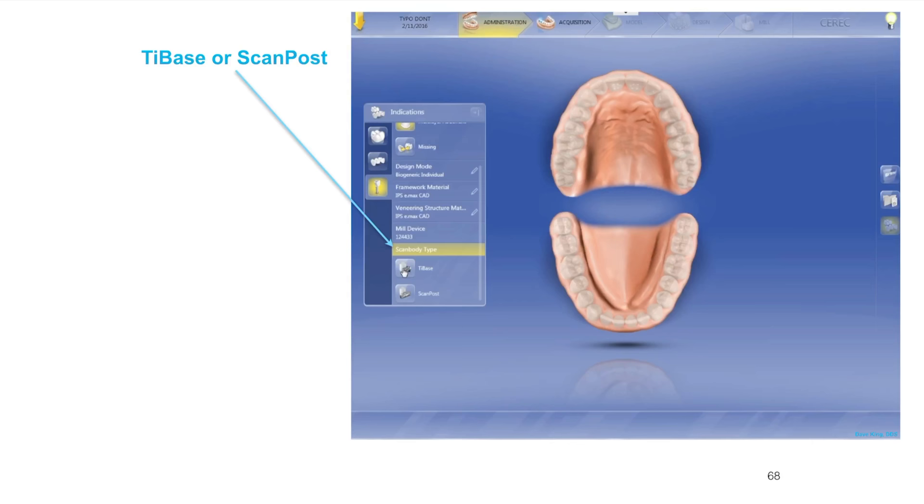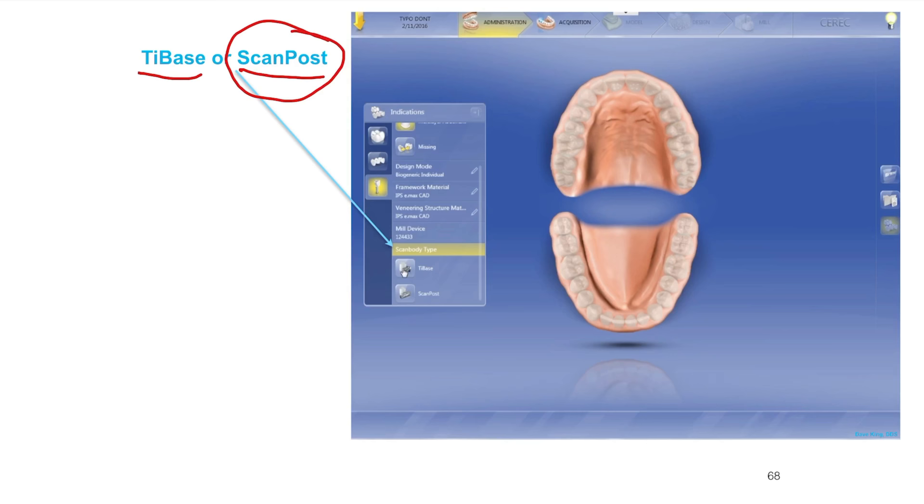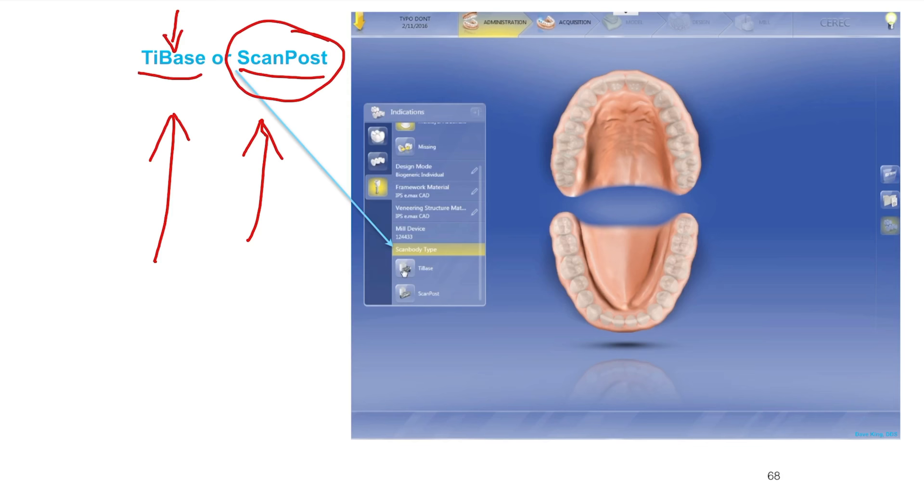For the veneering structure we're going to select the materials, I'm selecting Emax. The next step we have is, are we going to do a tie base or a scan post? We'll talk about the difference. Usually the scan post is a much simpler scan because it's taller, it's easier to orient the scan body on the scan post. It's a lot easier to see than the tie base in some situations.